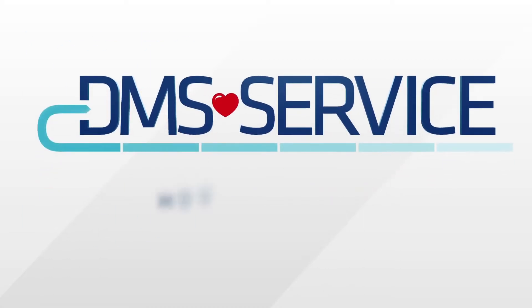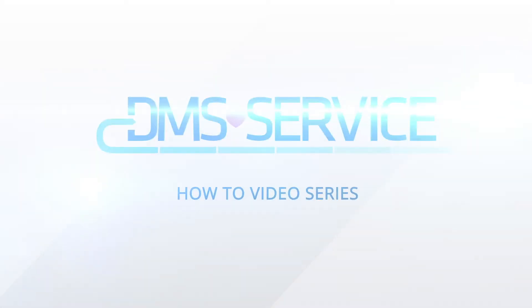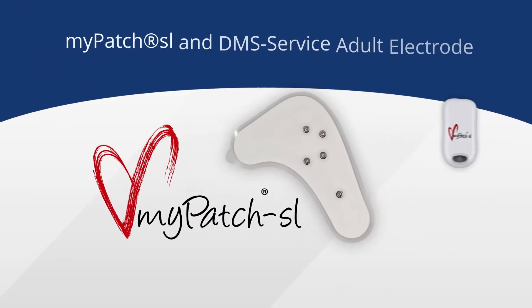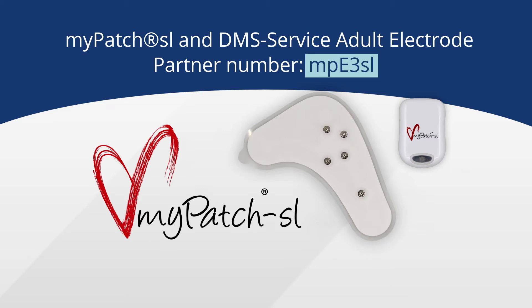DMS Service welcomes you to our How-To video series. In this video, we'll walk you through the simple steps of hooking up the patient to your MyPatch SL using the MyPatch SL adult electrode, which to confirm is Part MPE3 SL.